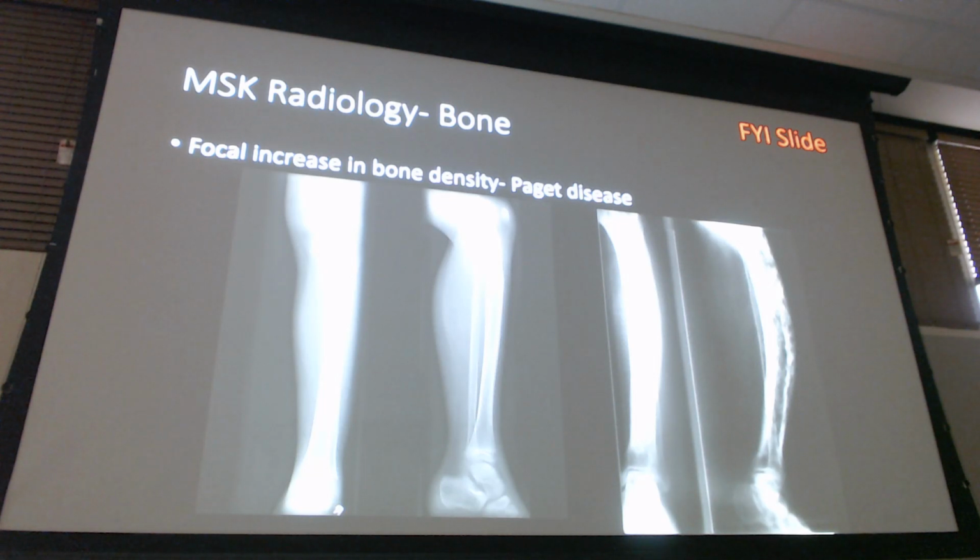But outside of that, I don't give you a lot of pediatric X-rays. Why? Because I don't need you to know when those growth plates fuse and when it's an actual fracture. Even your regular radiologists aren't always good at reading this. They have a special subspecialty for pediatric radiology. So they become a radiologist first, and then go to more school to specifically learn pediatric radiology because of the growth plates and how detailed and how important it is if you miss something on one of these, how much it can actually damage the kid's growth and other issues in life.